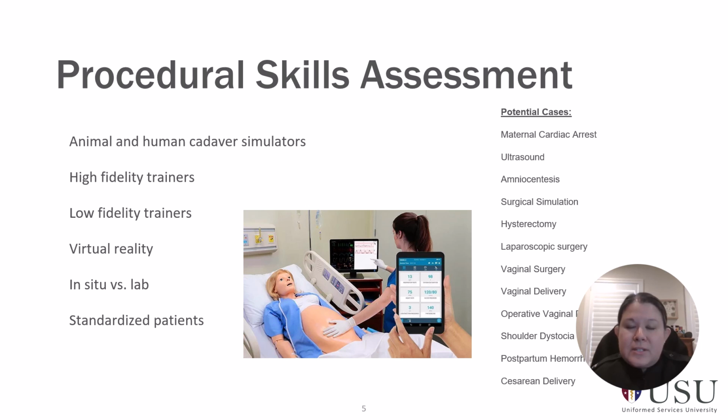So this includes things like box trainers and different components that can be used in a more realistic setting or specifically to teach different skills. And then there's virtual reality simulators. These can be very effective and very realistic in training.